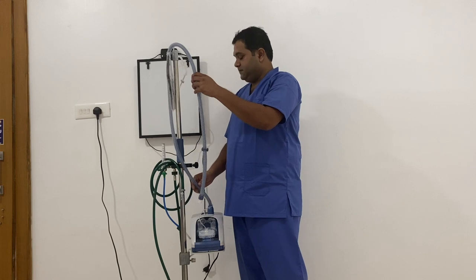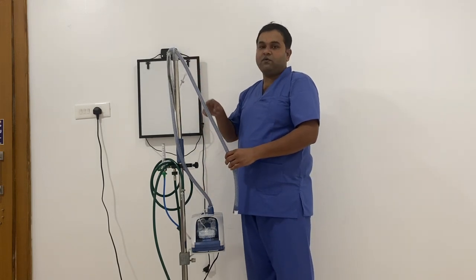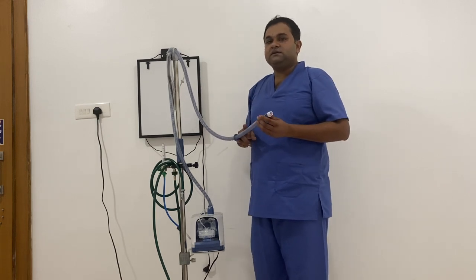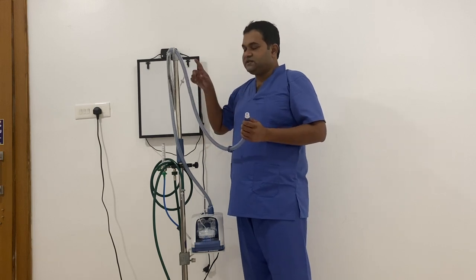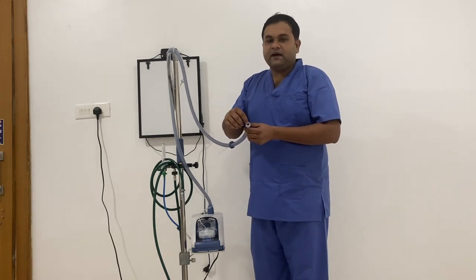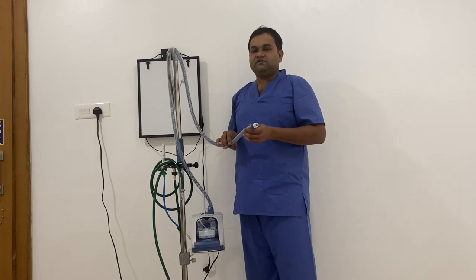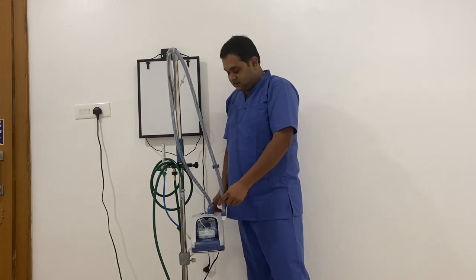This air piece has an inline heated wire. This ensures that the temperature and the humidity of the gas flow to the patient is maintained. There is another sensor at the end that again ensures that the temperature and the humidity of the gas flow is maintained, as set on this monitor.